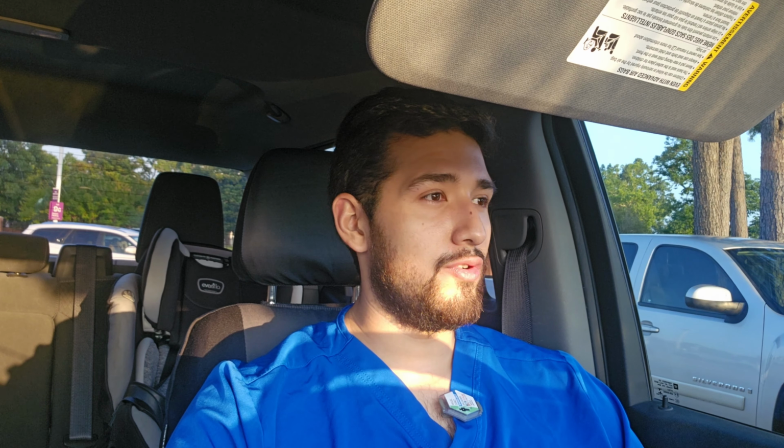Depending if it's something severe with their extremities, let's say it's a forearm, you might have to just do a PA instead of an AP forearm, and then cross table will kind of vary depending on the severity. I've seen some pretty wild ones. Any car crash, motorcycle vehicle accident, sometimes those people don't come in the most optimal shapes, and you've got to get creative sometimes to get those images depending on how it's broken.